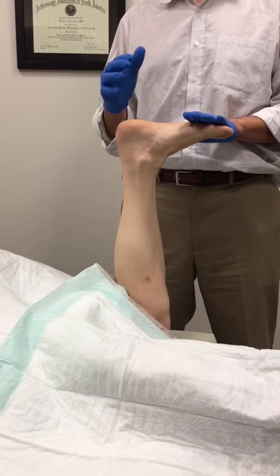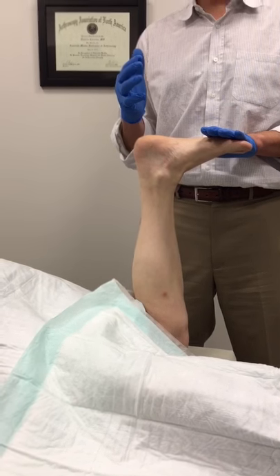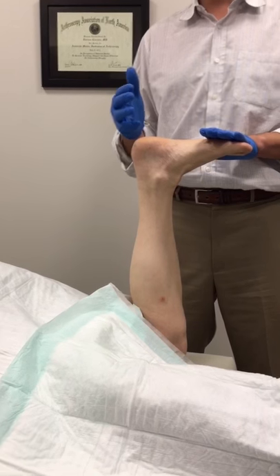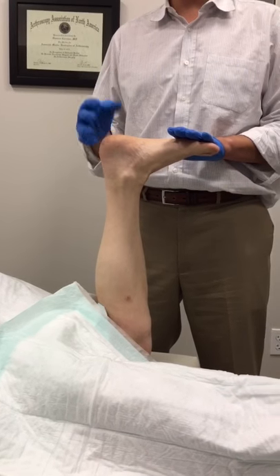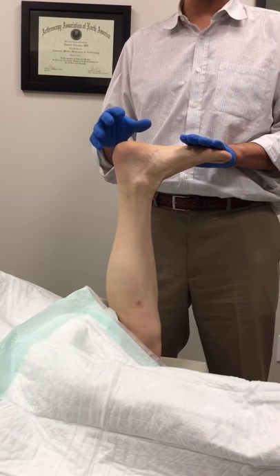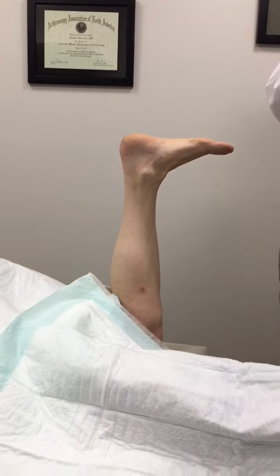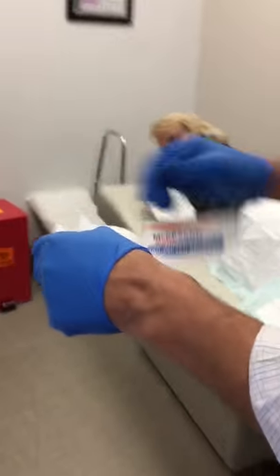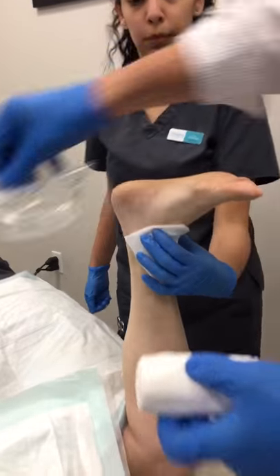I like to almost always have the ankle in neutral position at the time of placing the dressings. The exception being Achilles surgery, where the ankle is splinted in a resting position, which is in some plantar flexion. The majority of cases, including ankle fractures, we're trying to splint in a neutral position. So here she's neutral — we're going to just simulate an incision if she had an incision on the front part of her ankle, and we're going to have a dressing here, followed by a web roll.